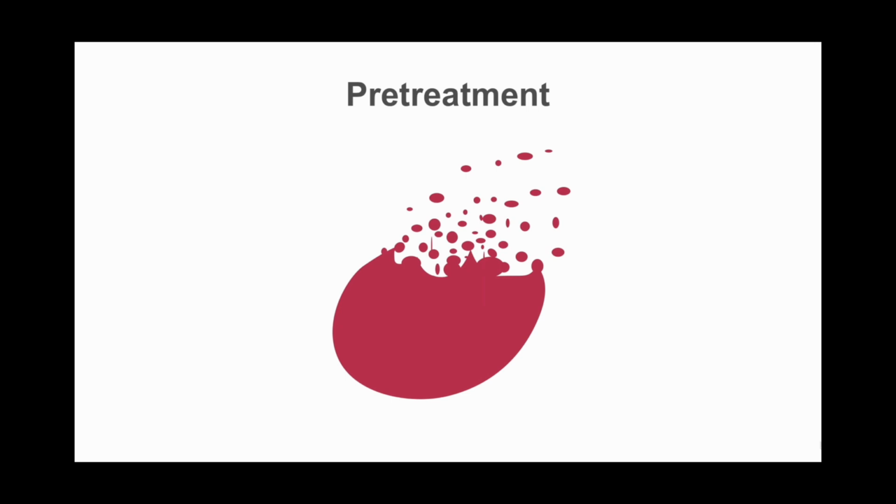Sometimes, when chlorine is unavailable, the municipality generally uses chloramine to treat the water. These chloramine compounds take more time than chlorine to be absorbed by the carbon treatment. That is why two filters are there in series, so that more of the chloramine can be removed.